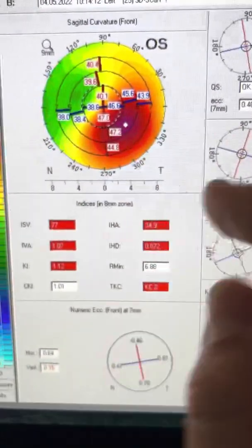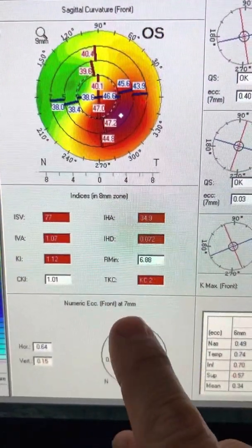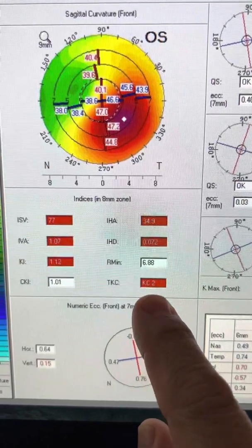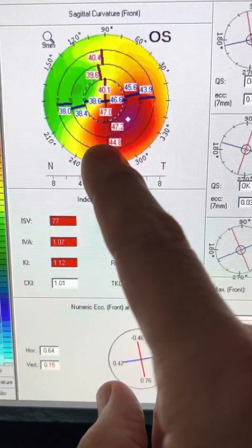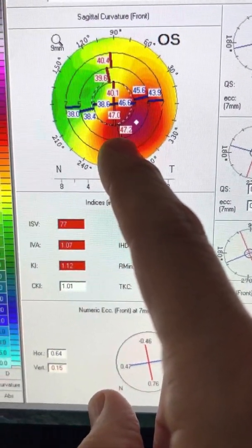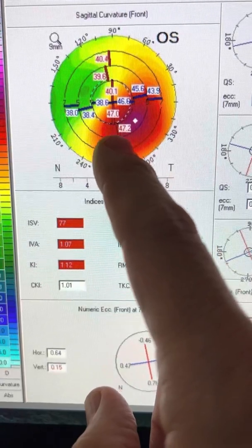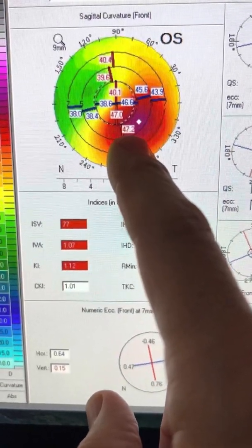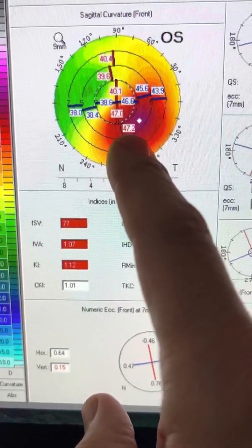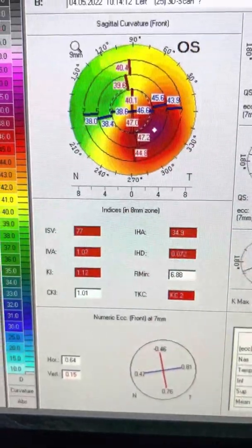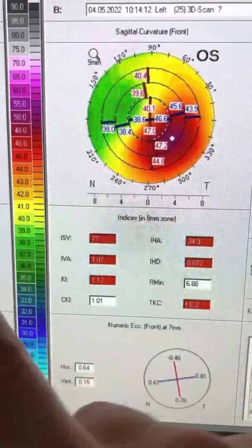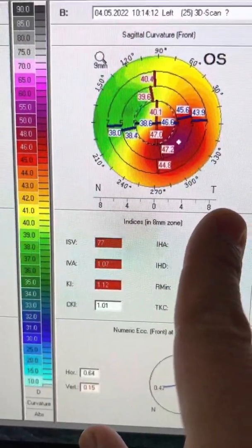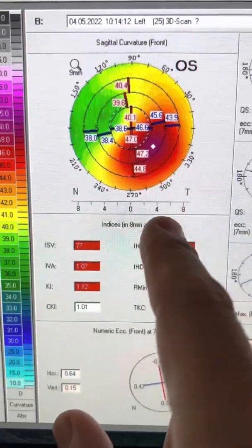The left eye that we see has more keratoconus, stage two of the Amsler-Krumeich. Steepest point yesterday 47.2, from a 46.5. He is not rubbing his eyes the last three years. Has this progressed? Should we cross-link the patient?